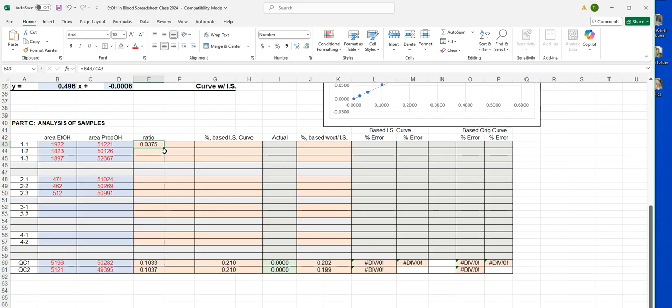When I click this cell box, I'm going to click that number again. In the bottom right-hand corner, there's a small square. It's a little box. I'm going to click it, and I'm going to drag it down. Notice it highlighted that area, and then I release the mouse. So it's going to apply that calculation all the way down.